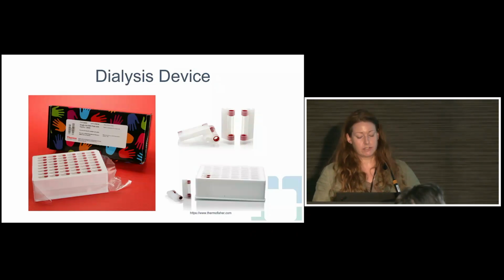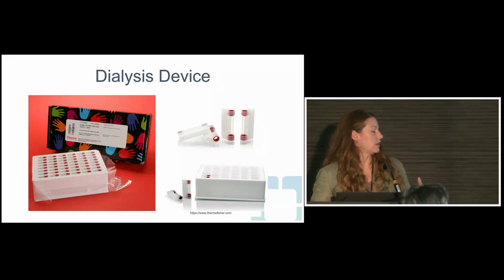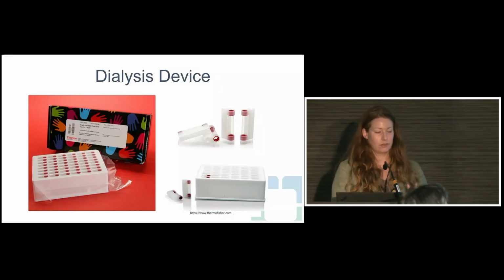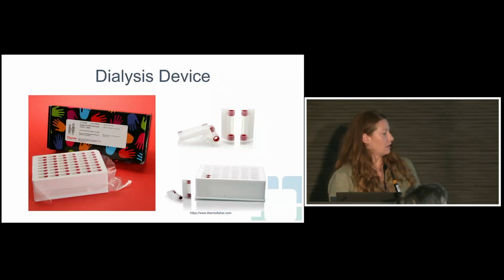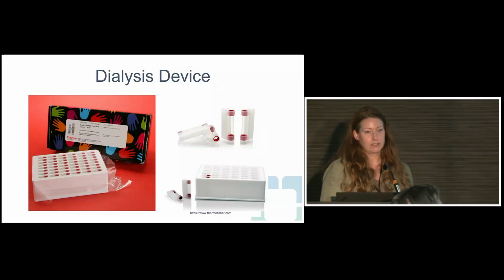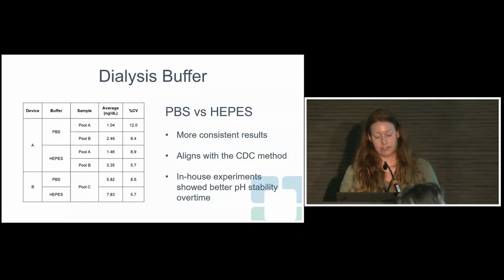So several of the devices that we tried, they have this chamber. So this chamber is open to the buffer, and there's a lot of surface area to interact with the buffer, which is really nice. Some of the other devices that we looked at, the membrane was encapsulated in a little cage, so there was less opportunity for interaction. Also, the tube construction with orbital mixing really gives you a lot of interaction there and can help with the amount of time you need for dialysis.